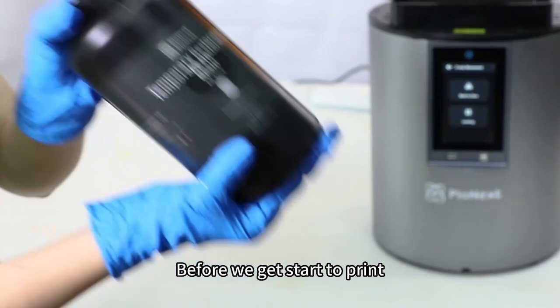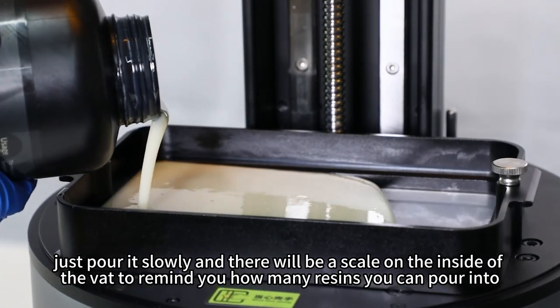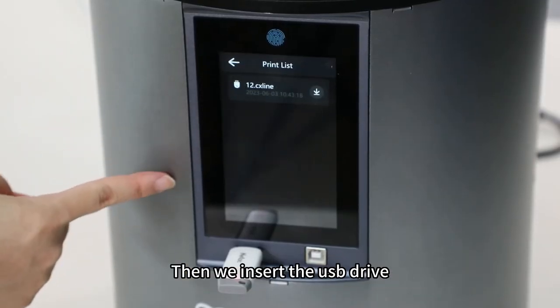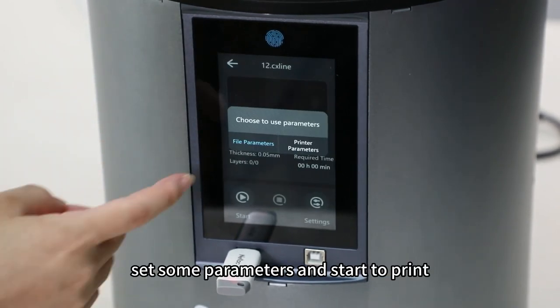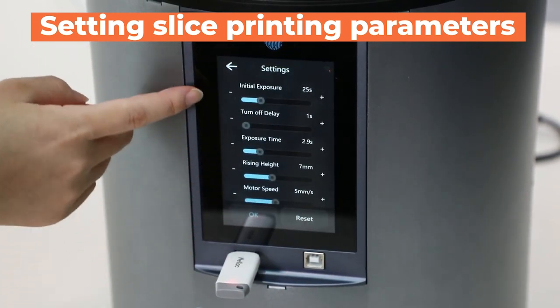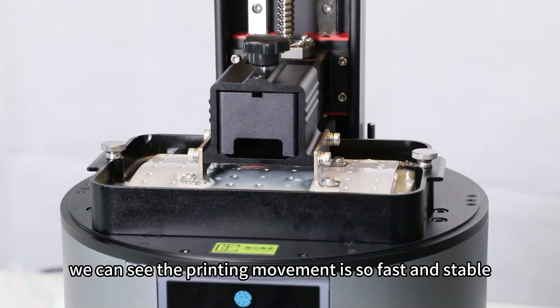Before we get started to print, we have to add some resin into the vats. Just pour in slowly — there will be a scale on the inside of the vats to remind you how much resin you can pour in. Then we insert the USB drive, click your model file, set some parameters, and start to print.